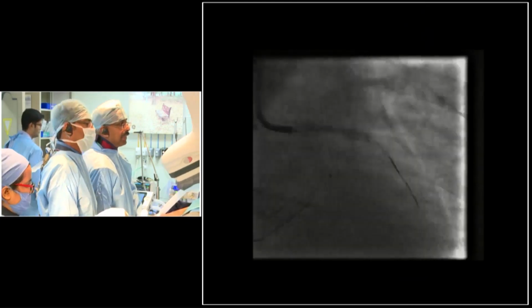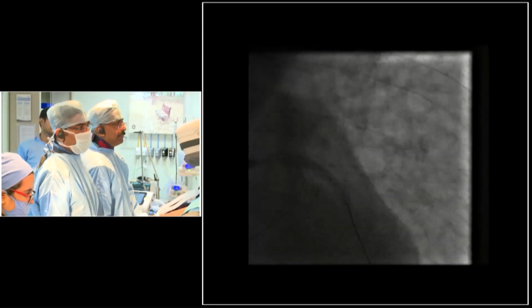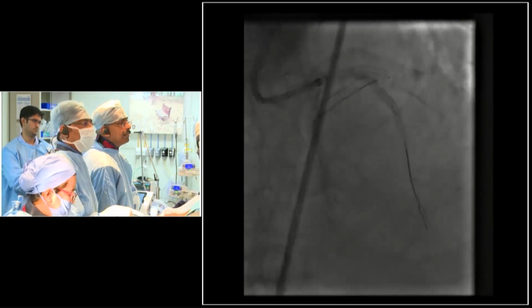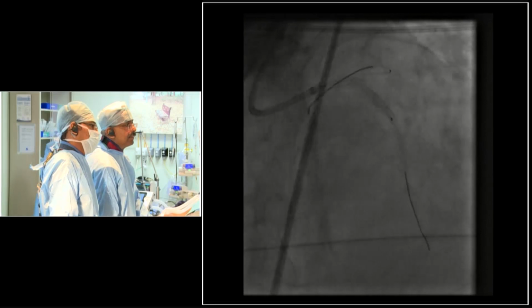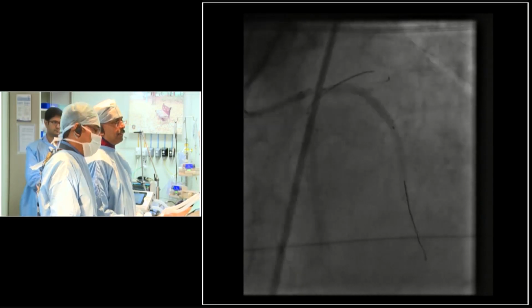I'll just pull that back and then go to a high pressure PA cranial, please. And keep the 3 millimeter balloon back and get a 4 millimeter balloon. Okay, go up. These two views you have seen, in both the views it is expanded well. Excellent.